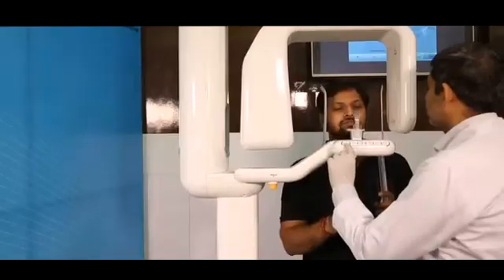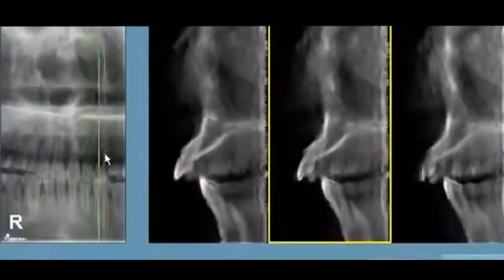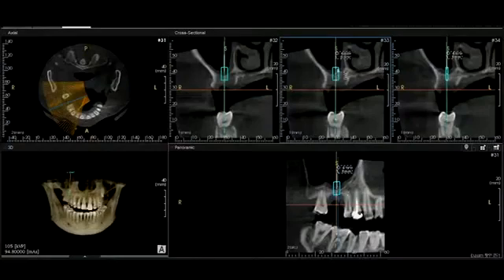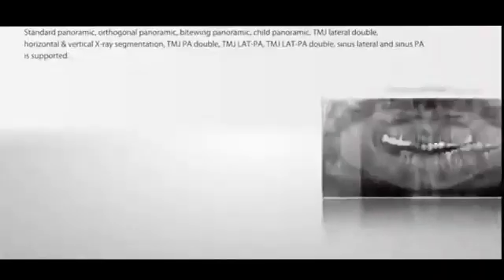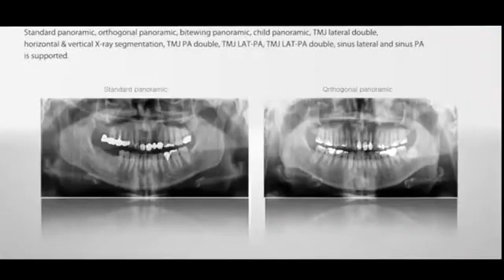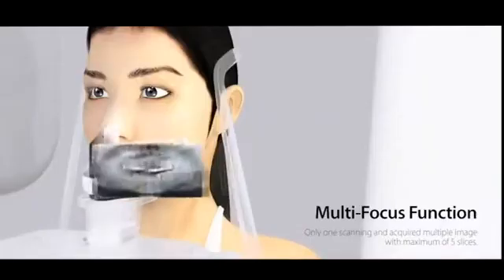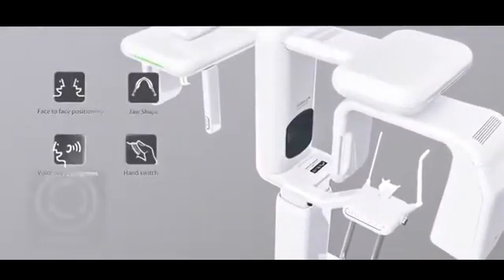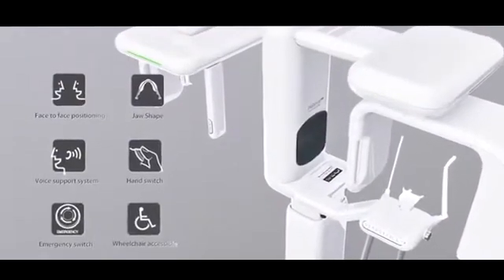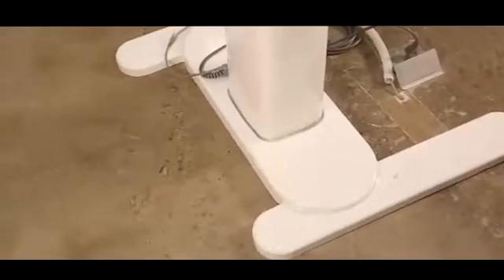When planning implants, the CAST image helps in understanding the jaw structures with sectional images. The CAST image is economical compared to expensive CBCT scans. The Papaya OPG offers panoramic imaging, sinus and TMJ view, variable focal trough, latest face-to-face positioning to fit each individual's jaw shape, voice support system, and wheelchair accessibility.